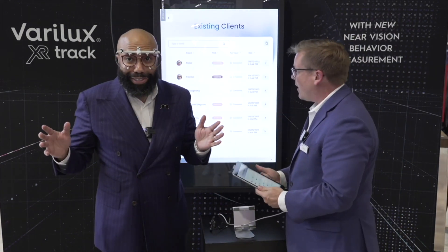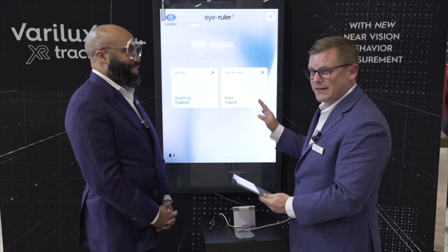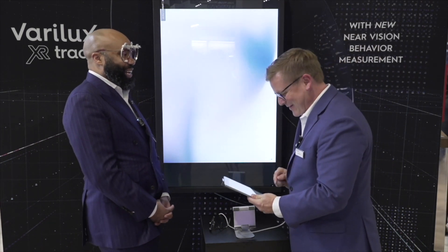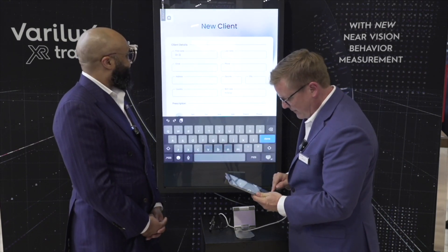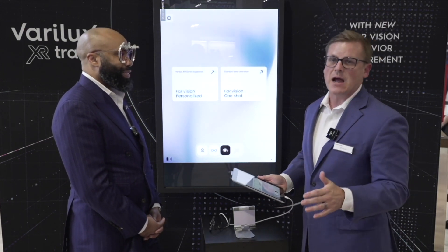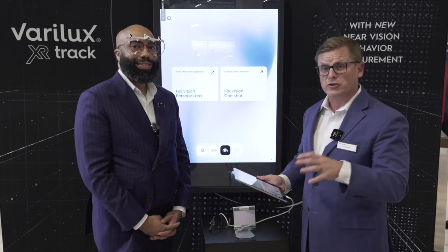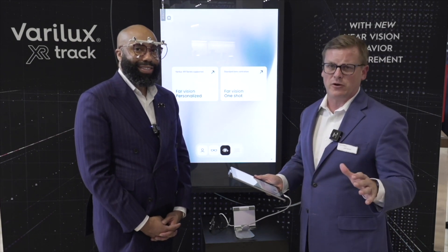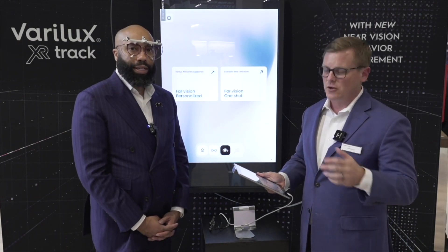We're casting up to the screen now. The monitor does not come with the Eye-Ruler 2. You would enter the patient's info and create a new client. With the Eye-Ruler 2, you can first take the near visual behavior measurement, which is exclusive to Varilux XR Track. But in just two pictures, you get all the other measurements you need: mono PD, fitting height, box measurements, frame wrap, pantoscopic tilt — the whole nine yards.